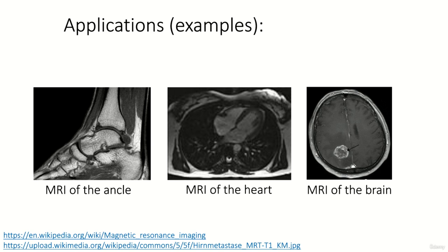In contrast to CT images, MRI is particularly suitable for the examination of soft tissues such as muscles, nerves, the brain, or organs. In the next and final lecture of this brief introduction into medical imaging, we will talk about the positron emission tomography.